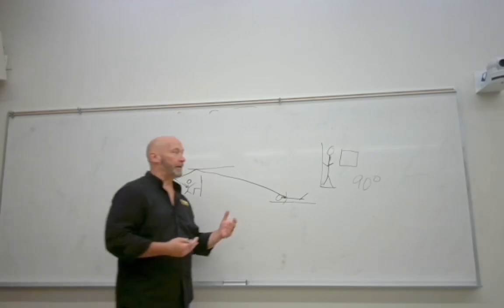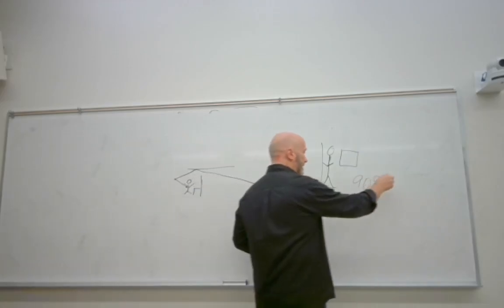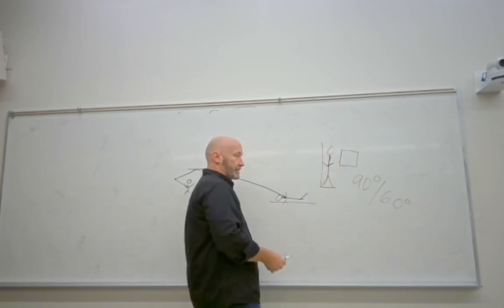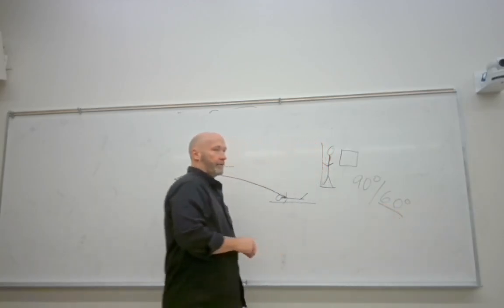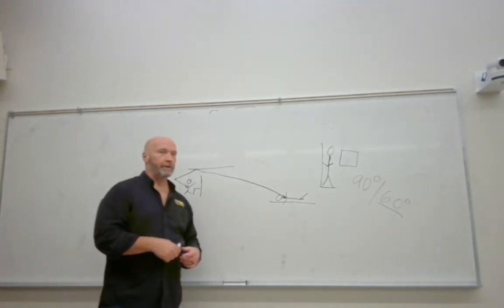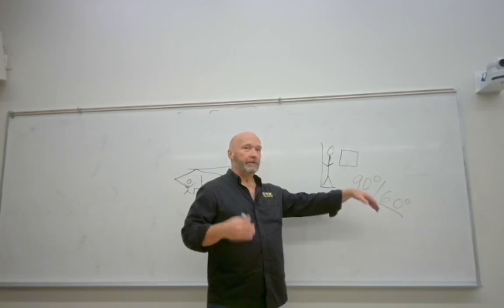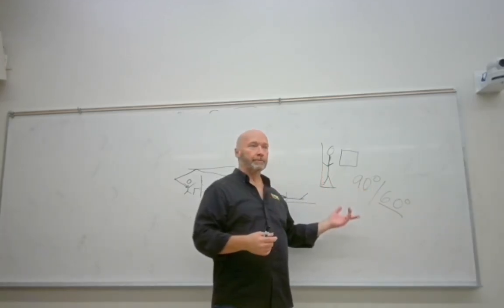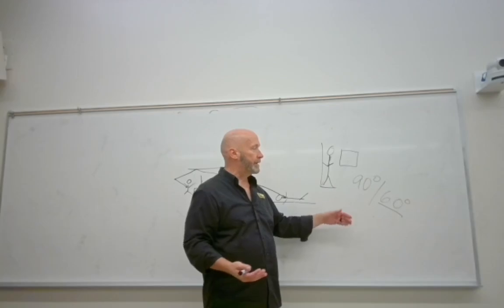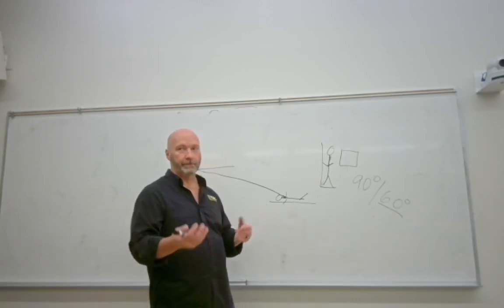I've worked in a system where it would go into Trendelenburg very steeply, and it was what we would refer to as a 90-60 room. So go 90 degrees in one direction so the patient can stand upright, but it goes into 60-degree Trendelenburg. That's pretty steep. Most of them are only going to go 30, 40 degrees into Trendelenburg. Okay. But that's going to identify the degree of tilt of the table in fluoro rooms. Doesn't apply to basic radiography rooms, just general diagnostic rooms that do fluoroscopy and radiography.